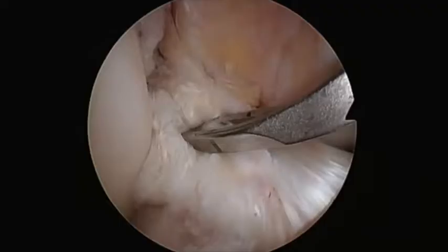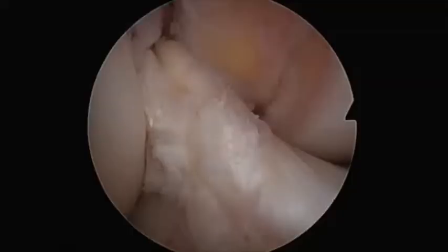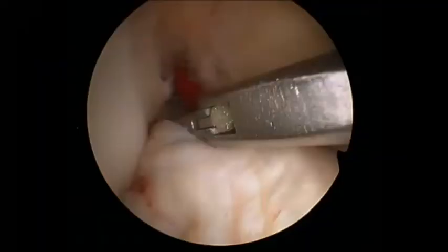The tibial ACL tunnel is drilled in an ACL remnant-sparing manner. The guide wire and drill are carefully drilled through the mid portion of the ACL stump. The guide wire is then exchanged for a fiber stick and the suture is removed through the anteromedial portal.